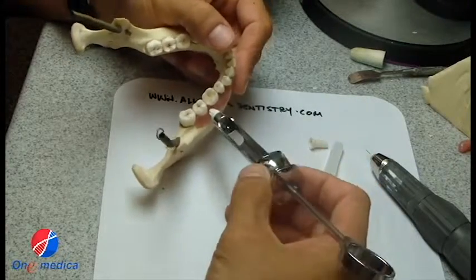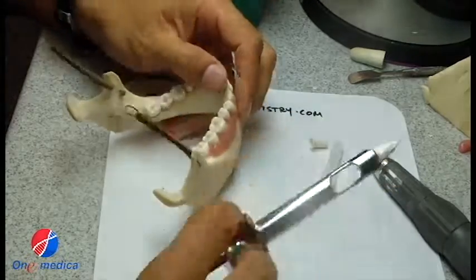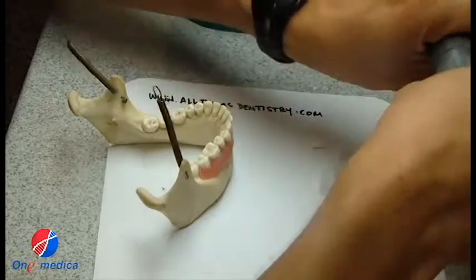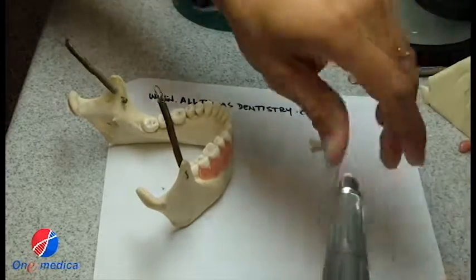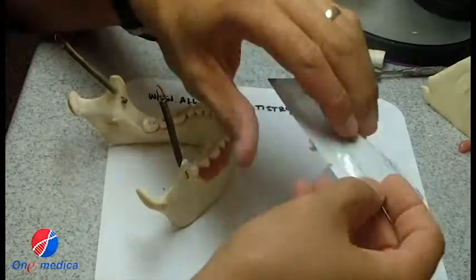I mean, it's a basic thing and it works. It's just finding that hole. So along came X-Tip. Same idea, but it has what's called a drill and guide sleeve.